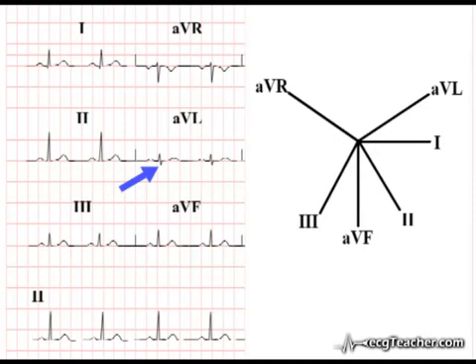This gives us two possibilities. As lead 2 lies at 90 degrees relative to AVL, the total frontal vector may be traveling towards lead 2 or traveling directly away from it. But look at the morphology of the QRS complex in lead 2. It is strongly positive with a tall R wave indicating that depolarizing forces are in the main traveling within 90 degrees of this lead. Therefore, option 1 must be correct. The total vector generated when we add together all frontal depolarization vectors must be traveling towards lead 2.